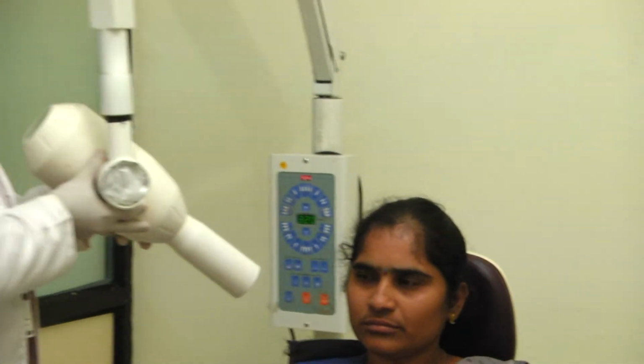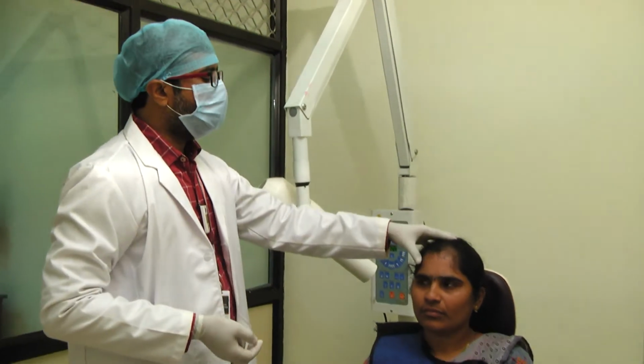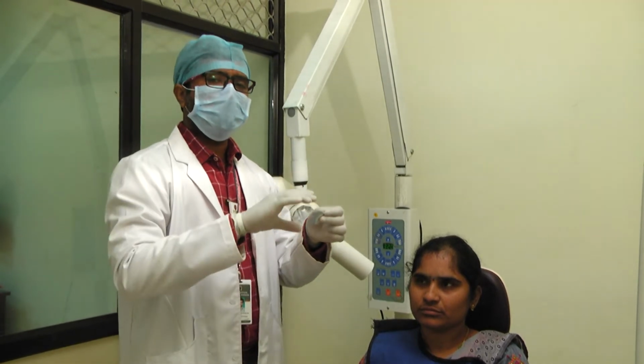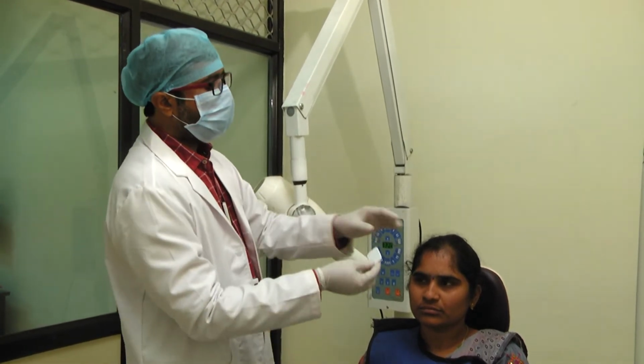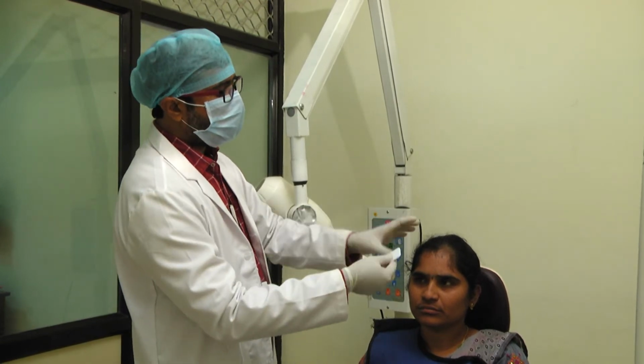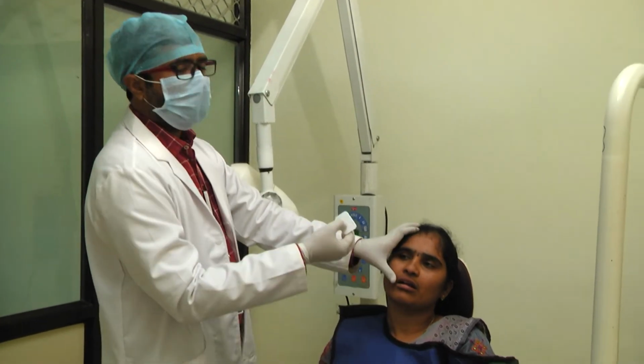And now coming to the maxillary premolar. For maxillary premolar, always place the film in a horizontal projection. So horizontally place the film, and see to it that the raised dot or knob is towards the occlusal surfaces, and the region of the tooth should be exactly in the center of the film.